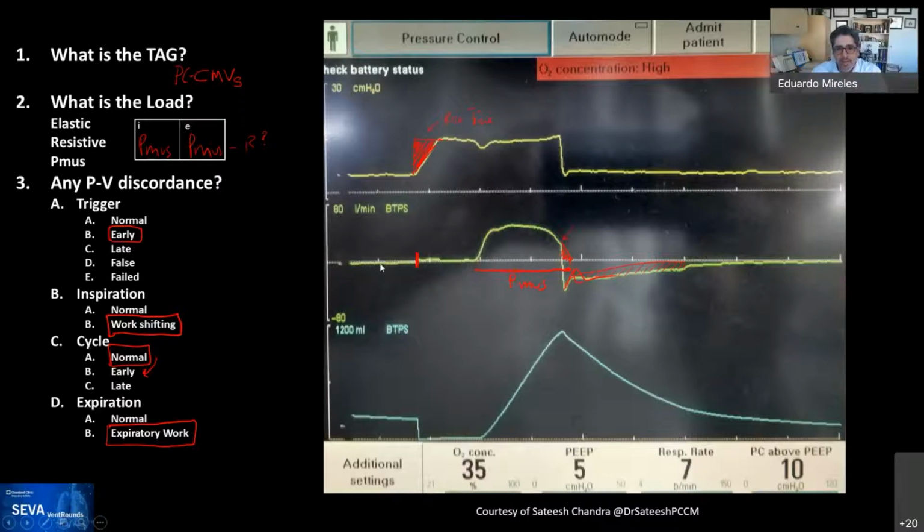I think I'm more inclined towards expiratory muscle activation, as Satish is saying, and the patient breathing against the device. So now let's see another case. Actually, that's why this series is called like that. And I'll ask, is there any fellow that wants to do the next one? I see here that Chris, Garab, Mariam are all in the fellows room, so we will never know who was answering. But do you guys want to try to tackle it as a group? Are you up for it?